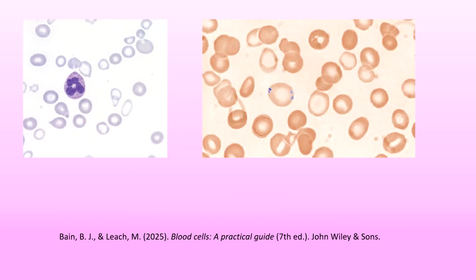On your left is a blood film showing hypochromic red cells in a patient with iron deficiency. You can also notice that there is anisochromasia. There are some polychromatophils here. On the right is a dimorphic blood picture in which you have these microcytes and pencil cells along with these large macro-ovalocytes. So both types of morphology are there. And this is a stomatocyte.